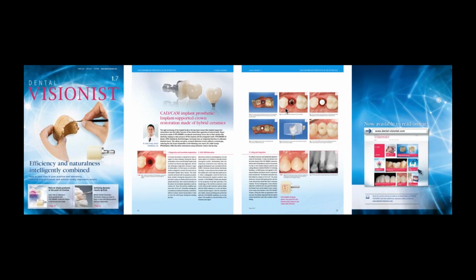So when you want to deliver this as a screw retained restoration, remember the first photo here: idealize the interproximal area of the neighbor teeth. Make sure that you have a nice and clean insertion axis for that final restoration.